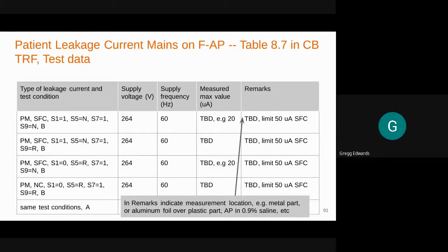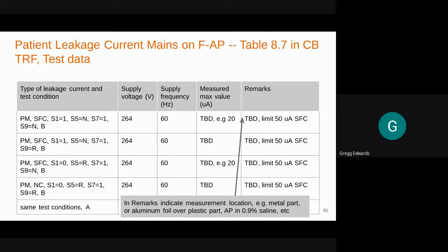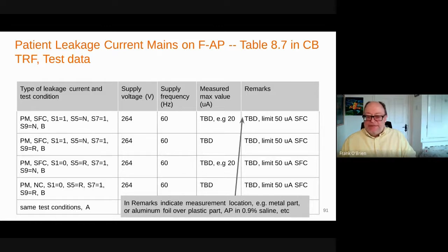Yeah, sometimes with the scope, you get a physical look at what's happening or where the leakage is coming from, and you can isolate different current sources because you'll be able to see those other than the mains frequency. Yep. All right, good. I think that's great feedback.